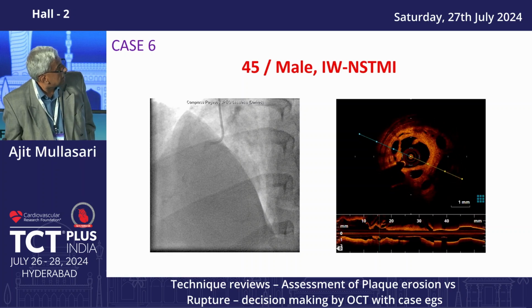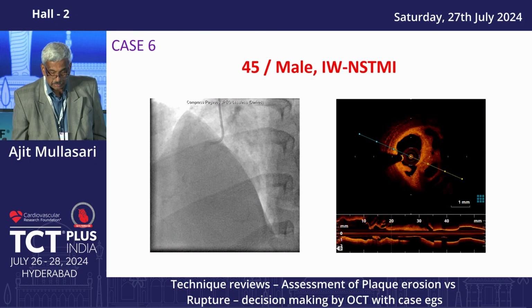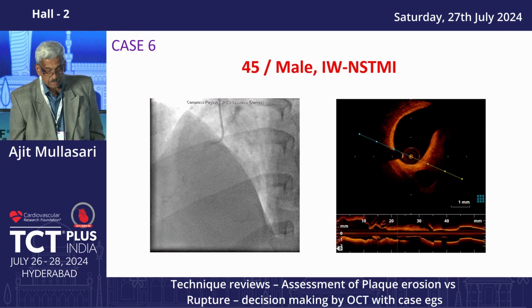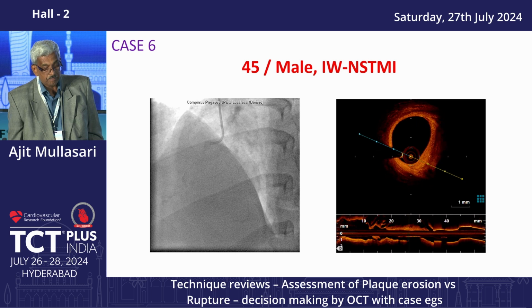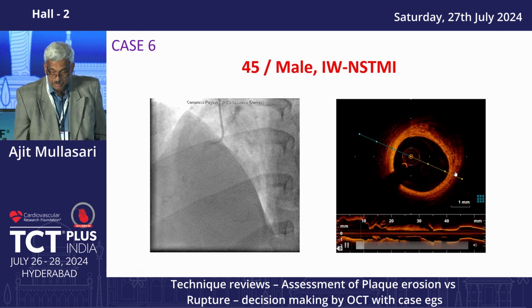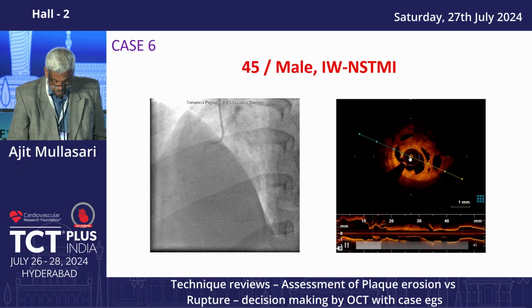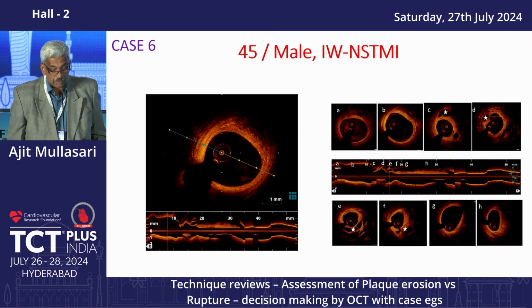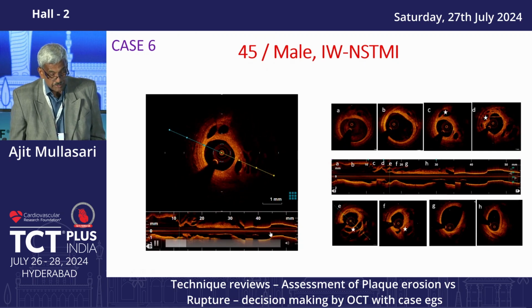Okay. Anyway, the OCT is showing clearly on the left side the typical lotus stem appearance, and this is typically a recanalized thrombus which is very clearly seen in this patient. So these patients are again very important patients that you have to be careful with. The flows are good in these patients, lumens are good.